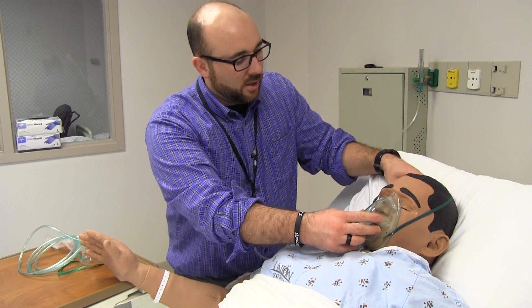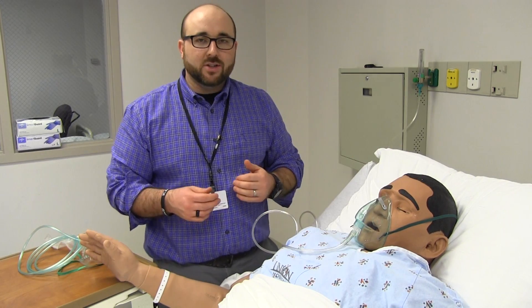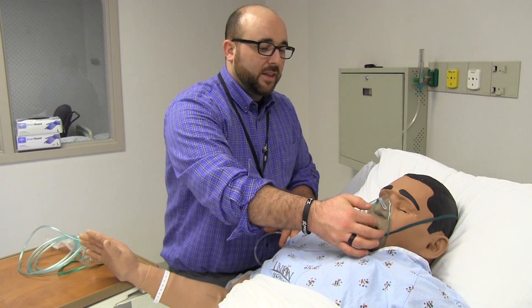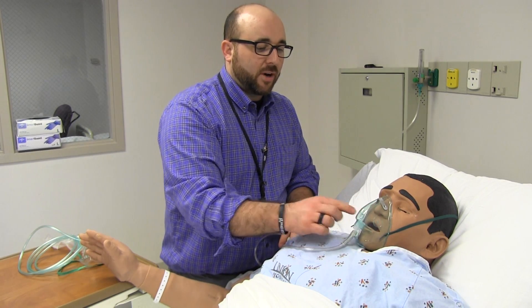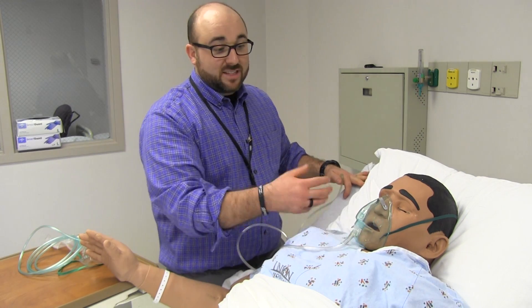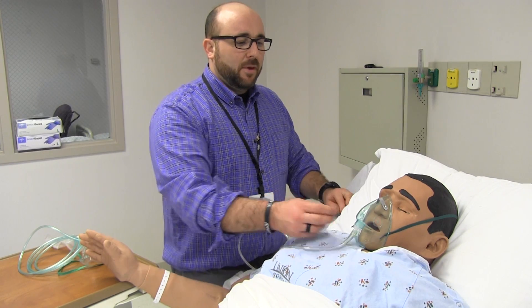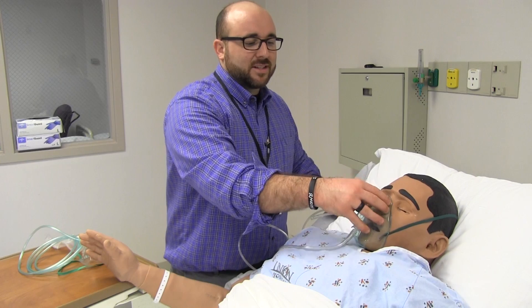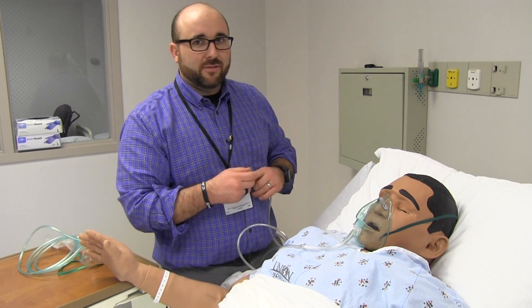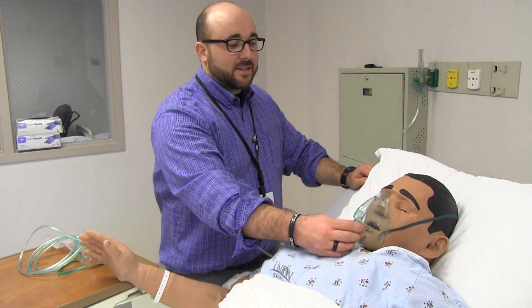Obviously it goes over the back of the head, and this part squeezes down on the nose so we can give the patient oxygen. One thing to note: there are holes in this part of the mask in case the flow is shut off and no longer coming to the mask. The mask will fog up so you'll know something happened. The patient will still be able to breathe — this isn't sealed to the face like a CPAP mask — but it will be uncomfortable after about 30 seconds to a minute.